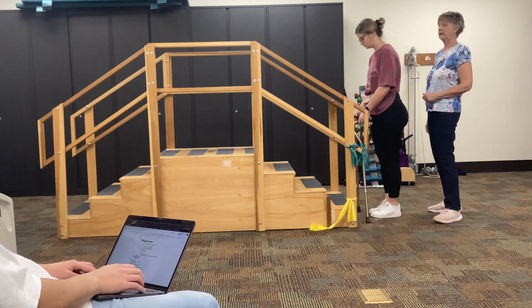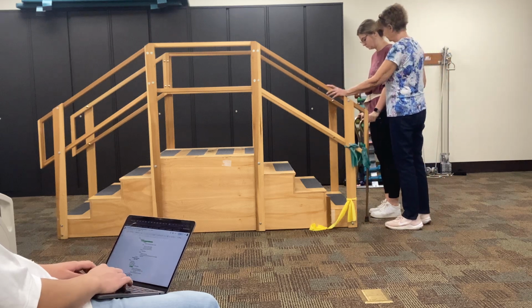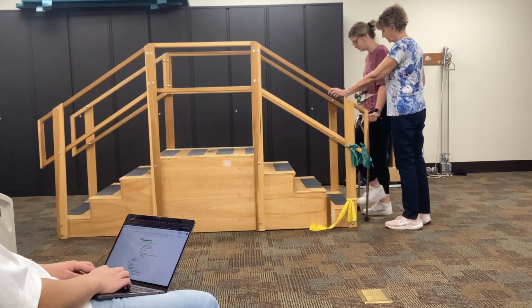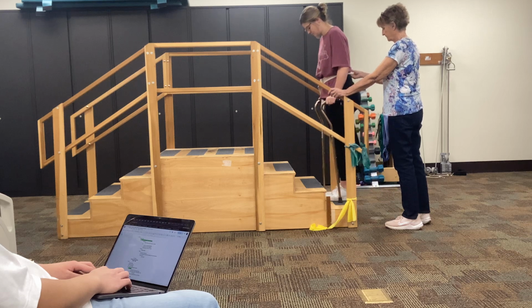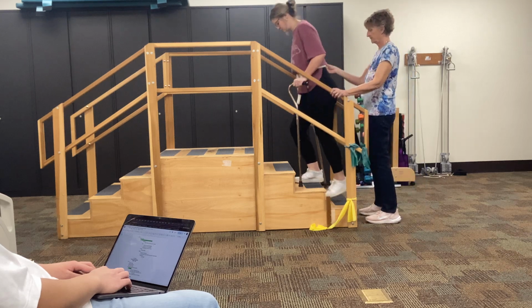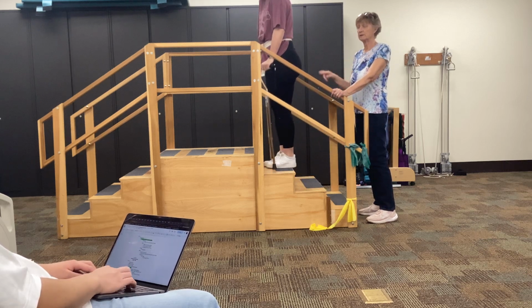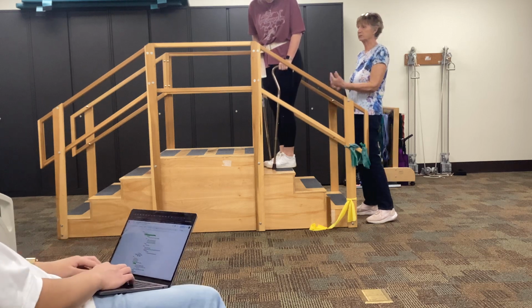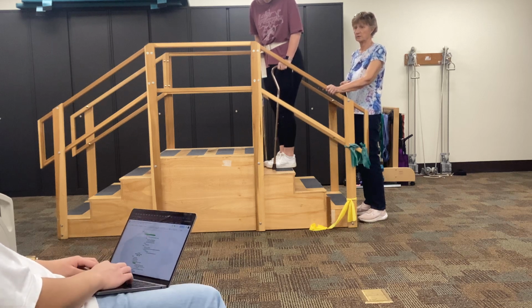So how do you think it would look for a progression for somebody with a 2-point gait? Same as walking. So, okay. Go ahead. Okay, so that is one progression, is to do it just to the same step. However, we would still follow the rule. She kind of switched legs there. We'd still follow the rule of up with the stronger.